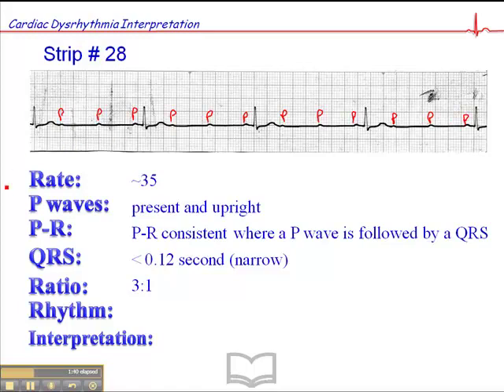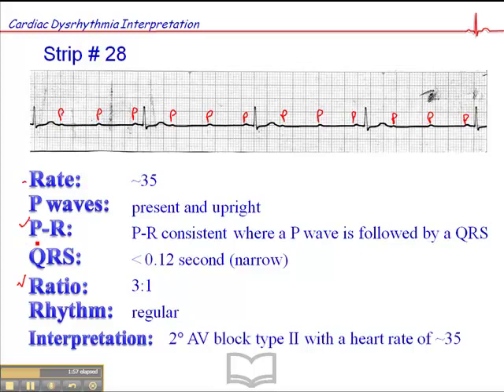So we have a consistent 3 to 1 ratio and the rhythm is regular. When you have a slow heart rate and a ratio of 3 P waves per QRS with a consistent PR interval, this is a second-degree AV block type 2 with a heart rate of 35 beats per minute.